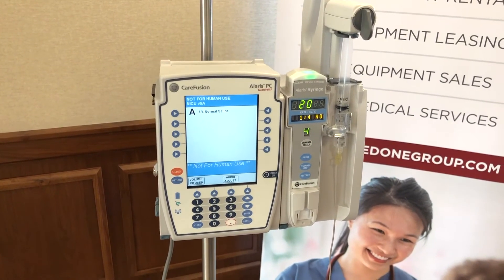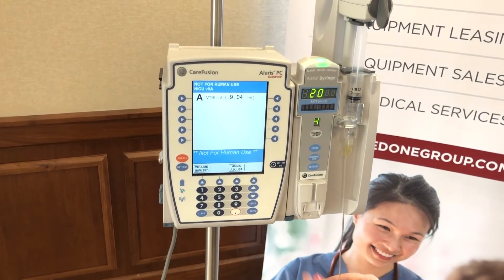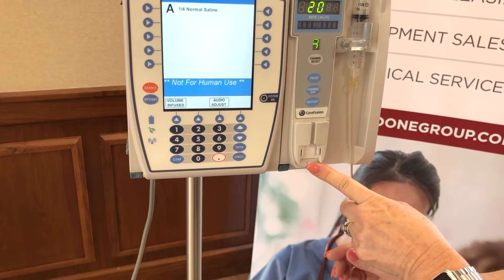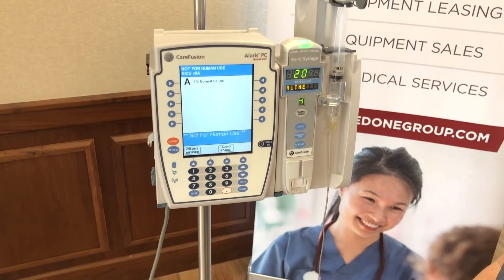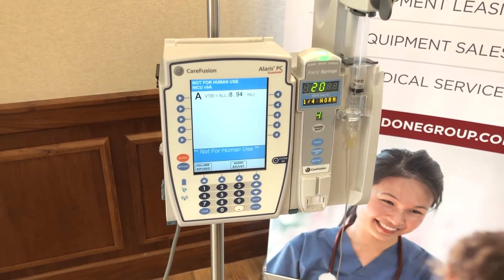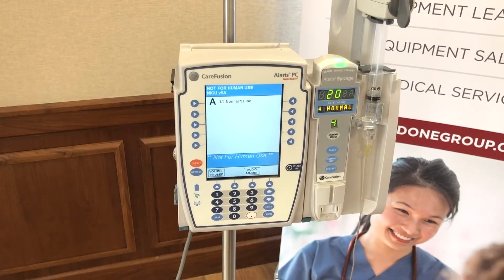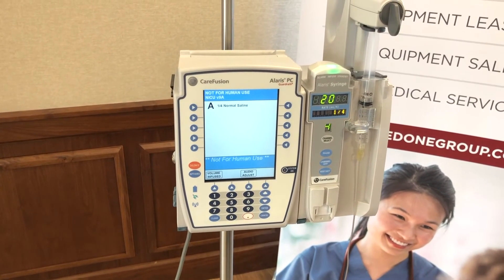On the bottom of the syringe pump there's a place to insert what we call the pressure sensing disc. This tubing is used for critical drugs on micro-preemie babies such as dopamine and dobutamine. It allows for real-time pressure monitoring in the line so you can see the actual millimeters of mercury of pressure when using that pressure sensing disc. Talk to your MedOne rep about getting that tubing if your organization decides they'd like to use it.